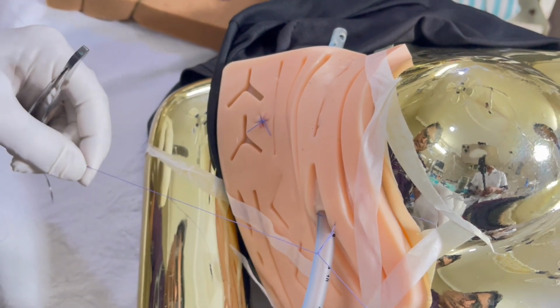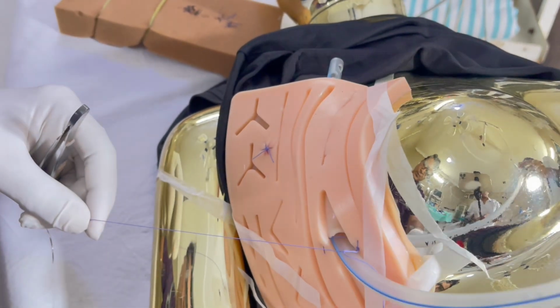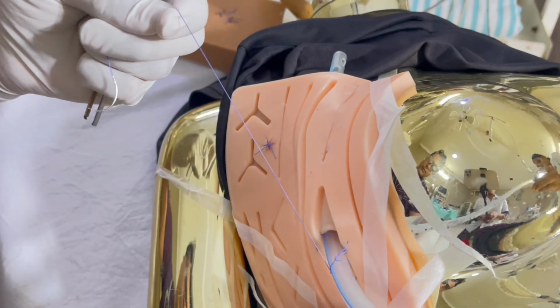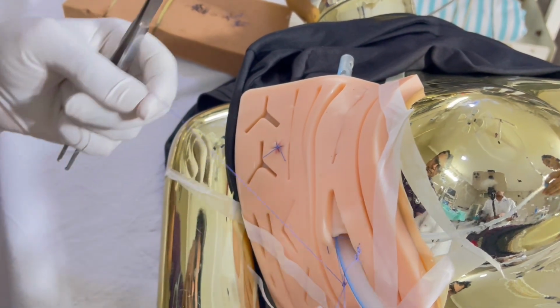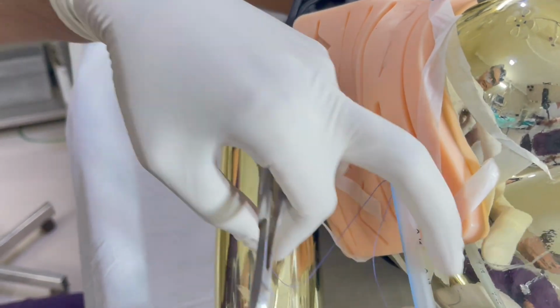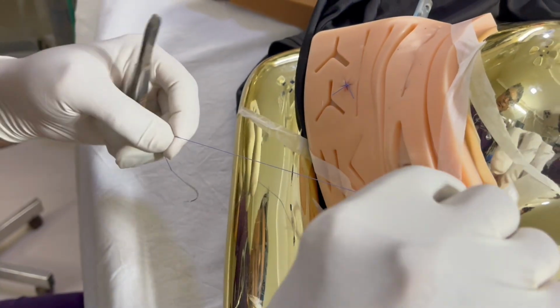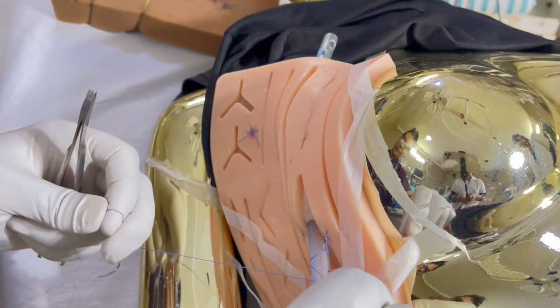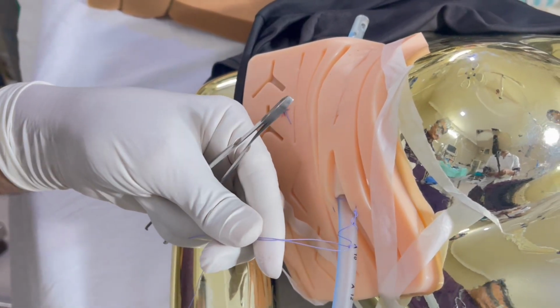So the drain is... so multiple sutures are taken in this manner, and the drain is fixed.